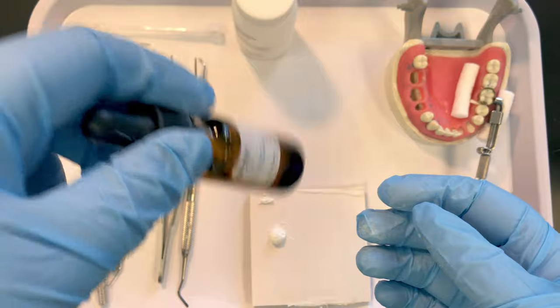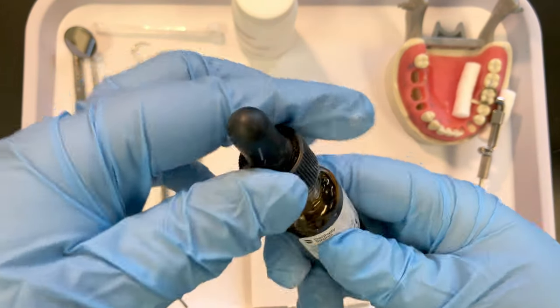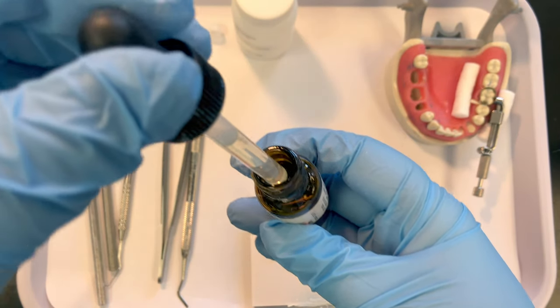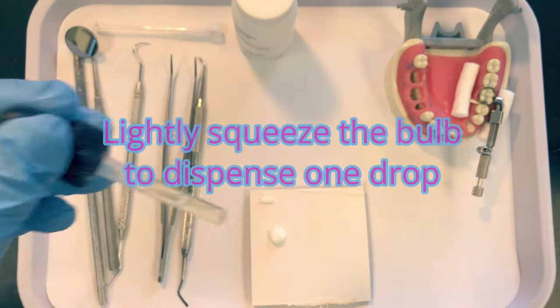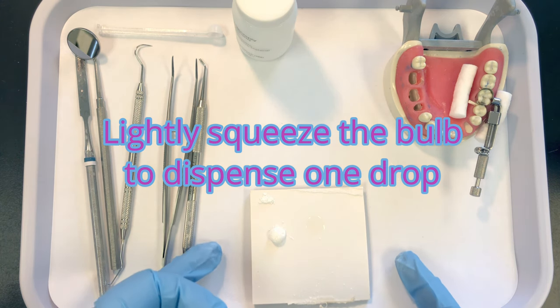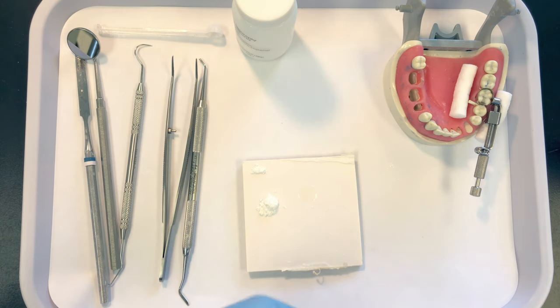Swirl your liquid — that just mixes the different components. This is similar to a medicine dropper. Make sure you hold it vertical and you want one full drop, dispensed away from your powder. It's very important to let the drop fall to the surface of your mixing pad.